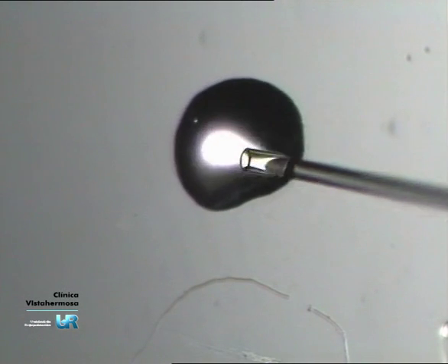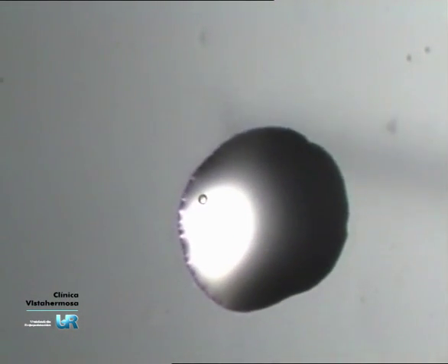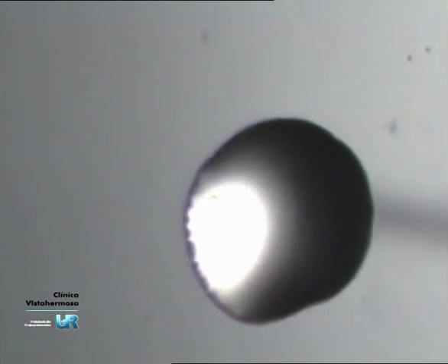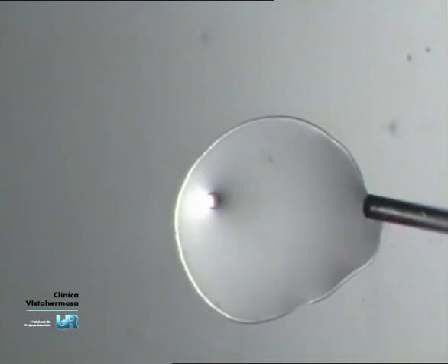After that, we put the blastomere on the microscope slide into a droplet of hypotonic solution, one or two microliters, using a pipette with 0.16 millimeters of internal diameter.